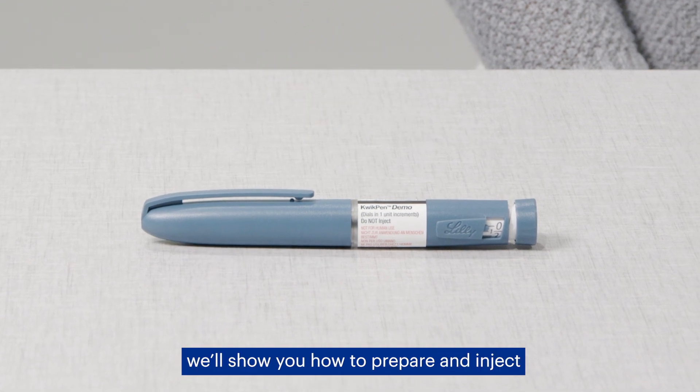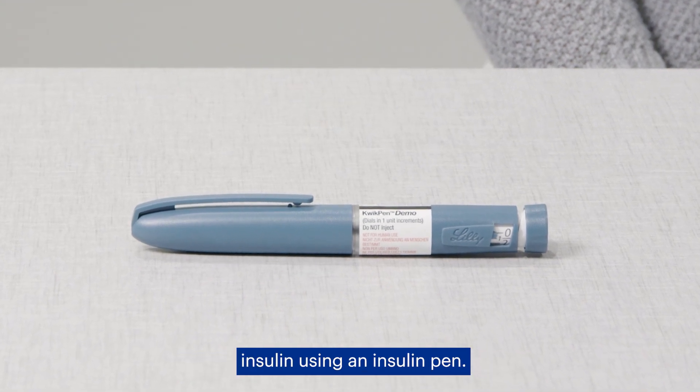In this video, we'll show you how to prepare and inject insulin using an insulin pen.